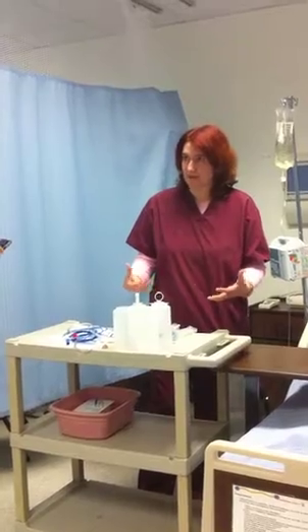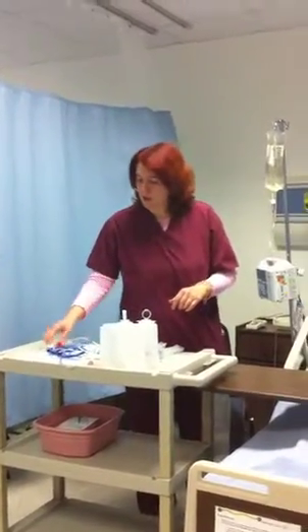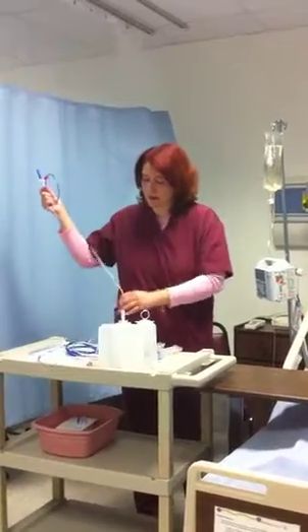You don't have to worry about using sterile technique, because what you're dealing with is the GI system, right? And we're putting food in our mouth all the time. The food is not sterile, is it? Okay. So what we need is, number one, we need an NG tube or nasogastric tube at proper size.